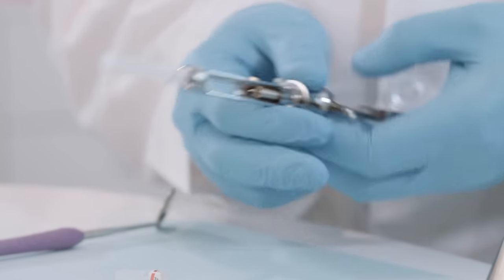Locate the greater palatine foramen by gently sliding a cotton-tipped applicator along the hard palate surface starting at the junction of the maxillary alveolar process and the posterior hard palate near the maxillary first molar. Move distally until the cotton-tipped applicator falls into a depression — the greater palatine foramen. Apply firm pressure with a cotton-tipped applicator directly over the depression to provide surface pressure anesthesia. Using a 27 gauge short needle, direct it from the contralateral side of the mouth at a 90 degree angle to the palate. Insert the needle slightly anterior to the greater palatine foramen, 3 to 6 millimeters, until the palatine bone is contacted. Aspirate, then slowly deposit approximately 0.45 milliliters — about one-fourth of the cartridge.